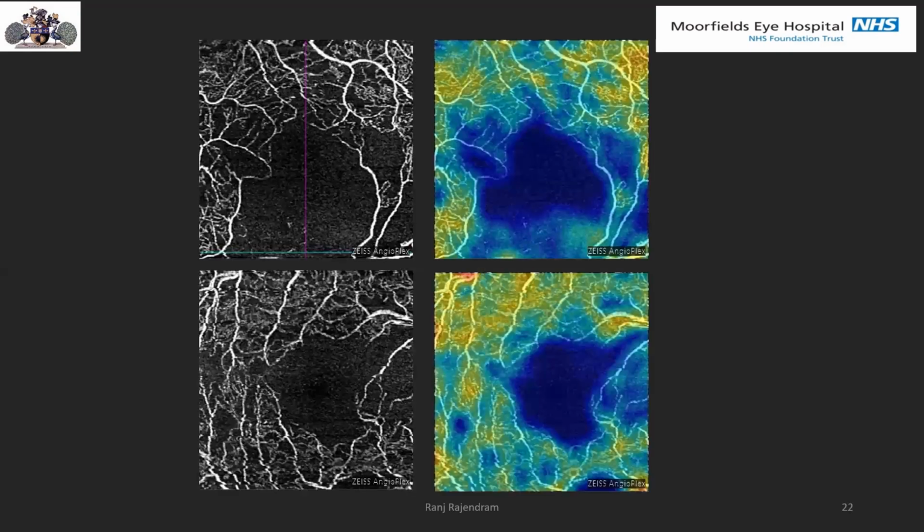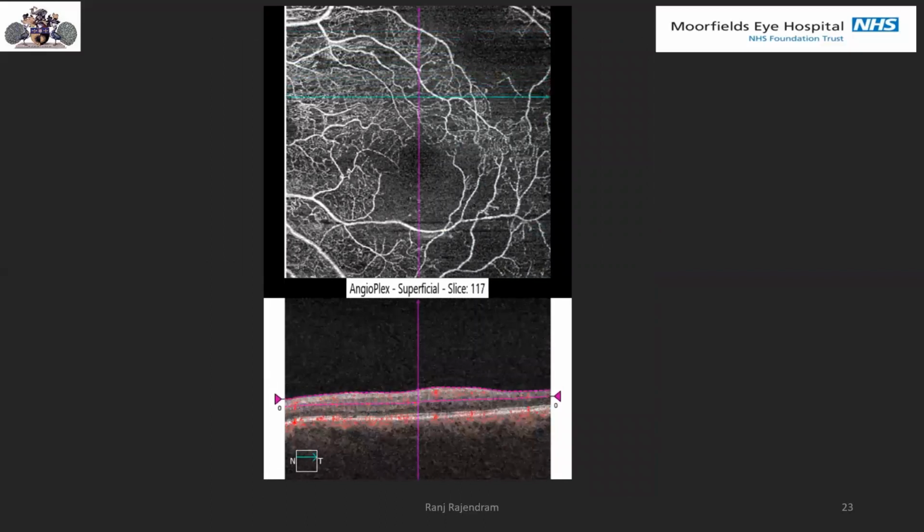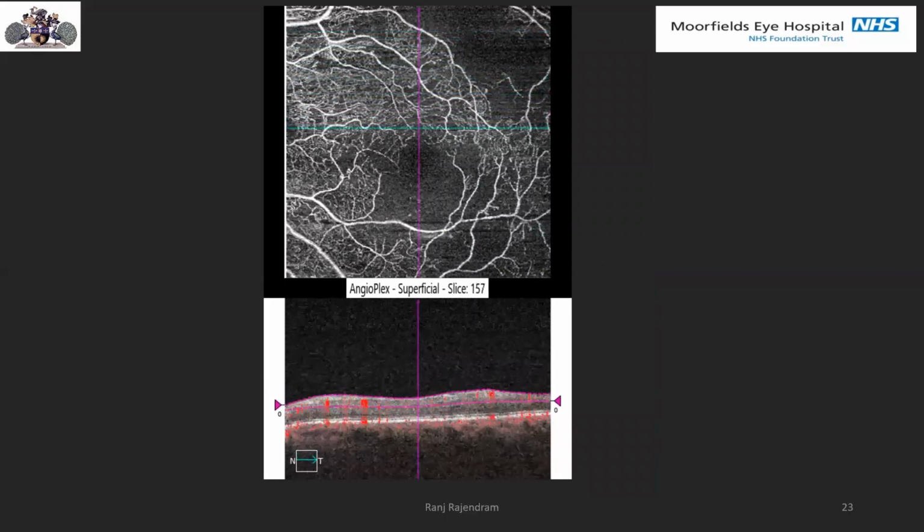Here we can see a map, a fusion map, density of both eyes, and we can see the capillary dropout, the irregular FAZ. And just showing these to a patient, they know what a normal retina looks like, and they know that this is not quite normal, and they'll become familiar with these images. As I said, we can repeat them sequentially, and we see them for a long time. If we scroll through, we can see very thin retina there, temporally where there's ischemia, and then at the center as well.